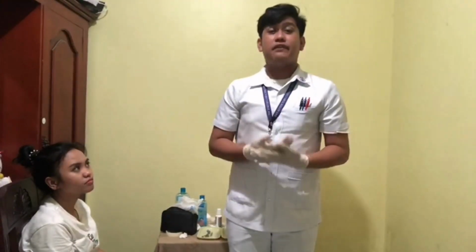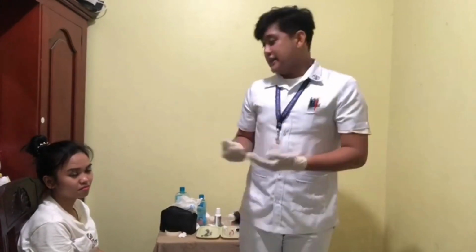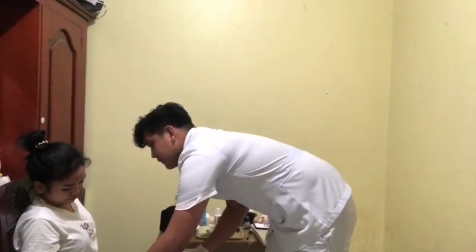The selected site should be free of tenderness, hardness, swelling, scarring, itching, burning, or localized inflammation. The site we'll be using is here on the abdomen of the patient, making sure that the skin of the administration site appears healthy and free from irritation and inflammation reduces the discomfort of injection. I am going to palpate for any skin lesions or swelling. Okay, ma'am. Since the patient has no swelling, I am going to start the medication.